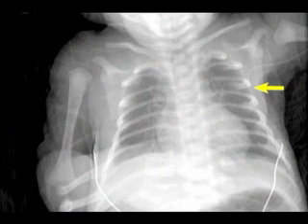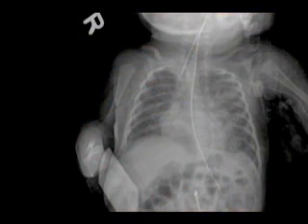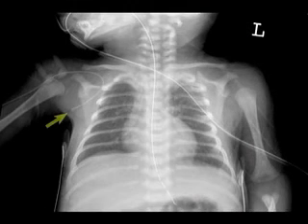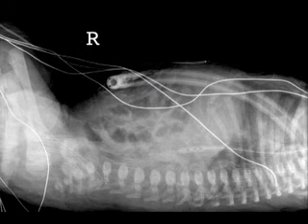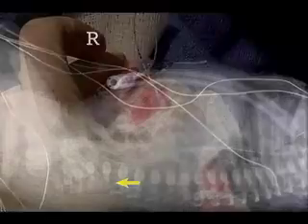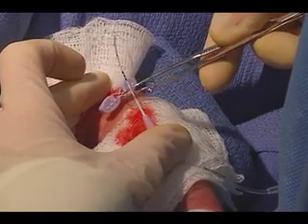The most common complications during neonatal PICC placement are malposition of the catheter tip and bleeding at the insertion site. Catheters placed in the arms and scalp can thread up the internal jugular vein, back into the venous systems of the arm or scalp, or across the innominate vein into the contralateral subclavian vein. Catheters placed in the feet and legs can enter the contralateral femoral vascular system, the lumbar vein, or renal veins. While maintaining a sterile field, you may retract and reposition the catheter in an attempt to obtain central placement.